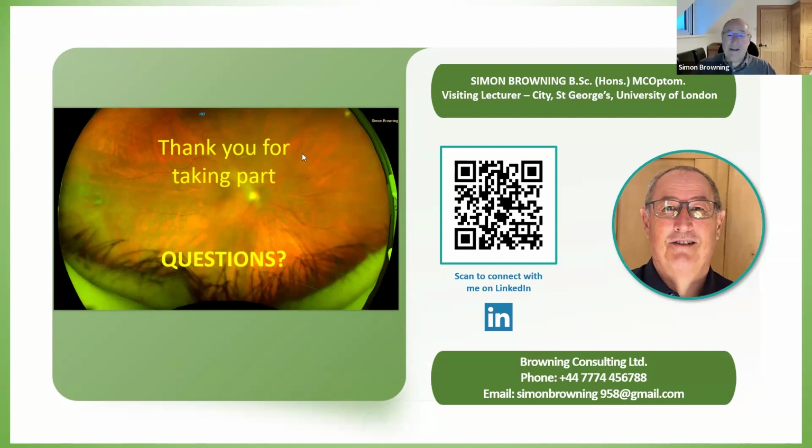Have a look at what's out there and also the software programs that go with it, because axial length is very much the name of the game. If you're practicing myopia control but you don't know the axial length of that patient, then what you're really doing is asking, am I controlling the refractive error? Because that's the only thing you've got to go on.